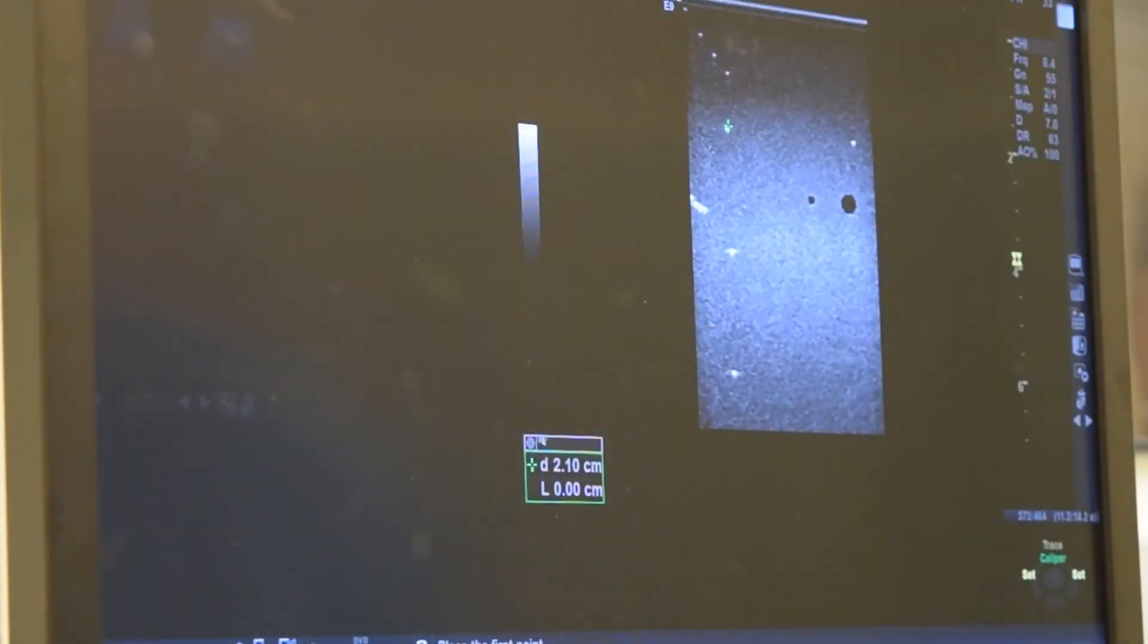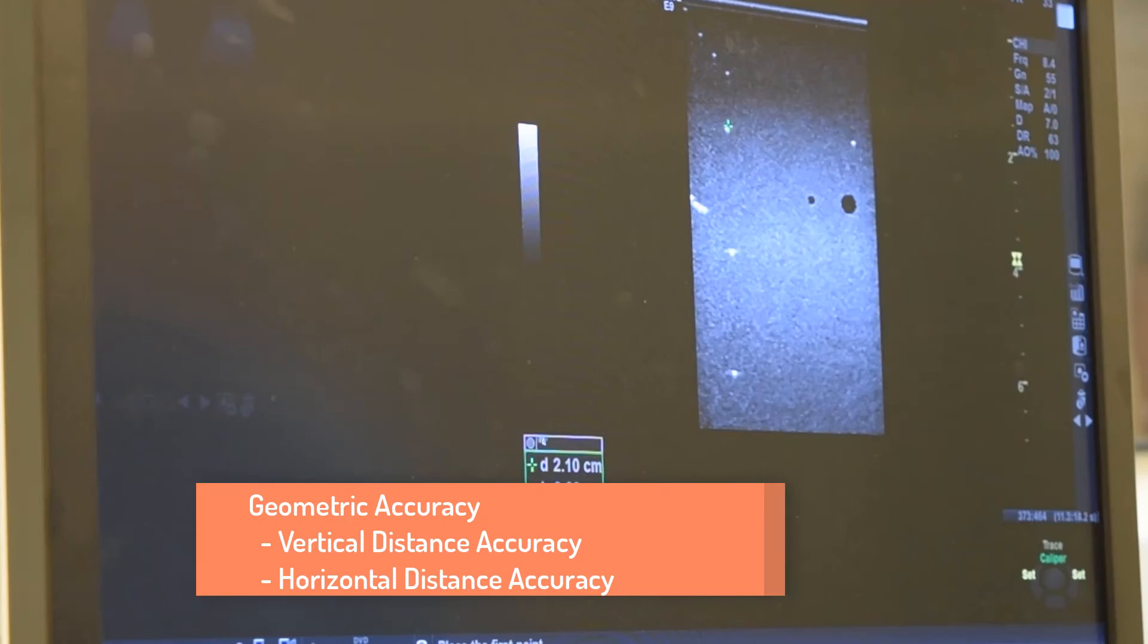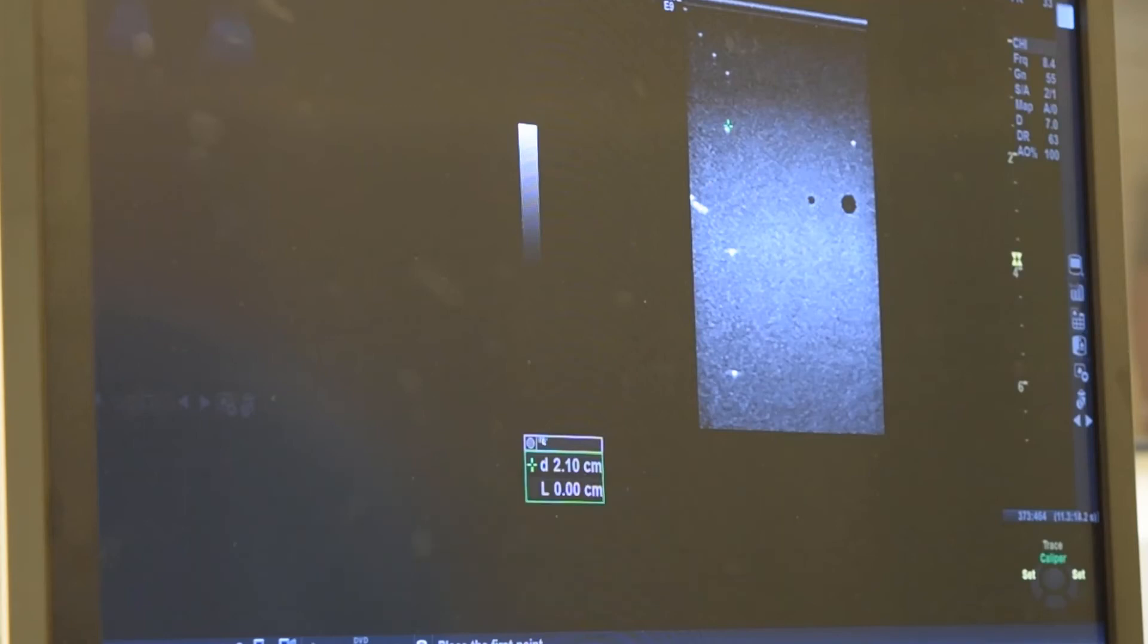The fourth test we carry out is to look at the geometric accuracy of the scanner, specifically how accurately are distance measurements done using a digital caliper. This is done using cursors that are set by the operator. There are two components, vertical distance accuracy and horizontal distance measurement accuracy. For this test, we've adjusted the field of view so that we can visualize reflectors down to a depth of around 7 centimeters.